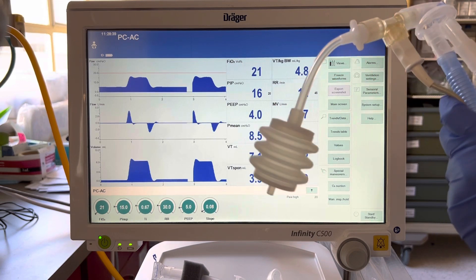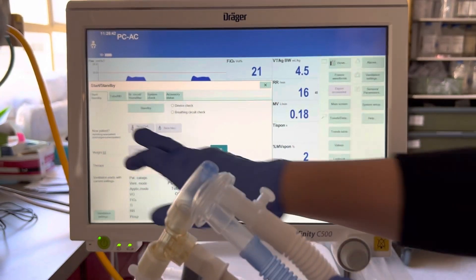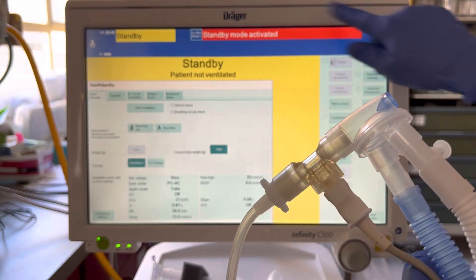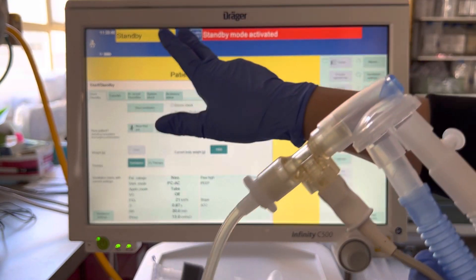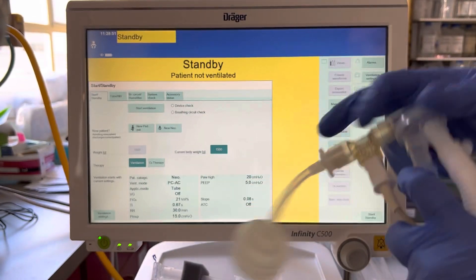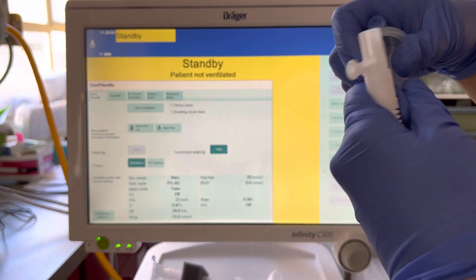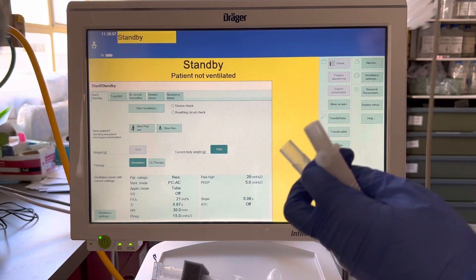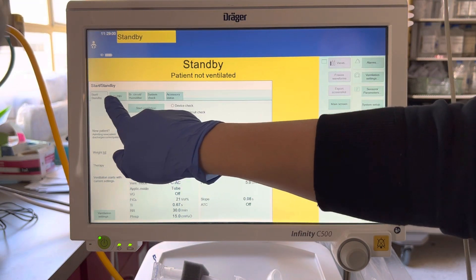The vent has to go on standby first. Press standby — it's going to show you a red mark, this is just to confirm that you want to go on standby. Clear that. Okay, now we're going to take this over.